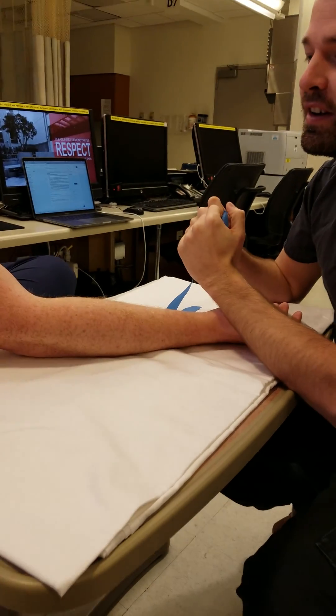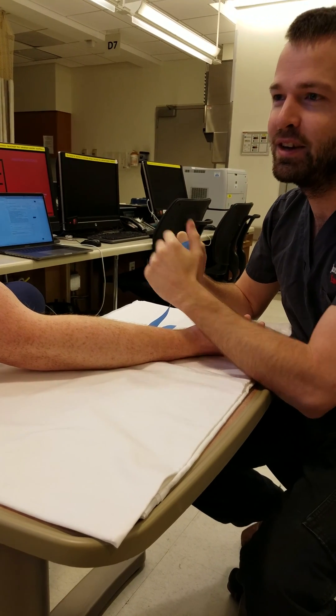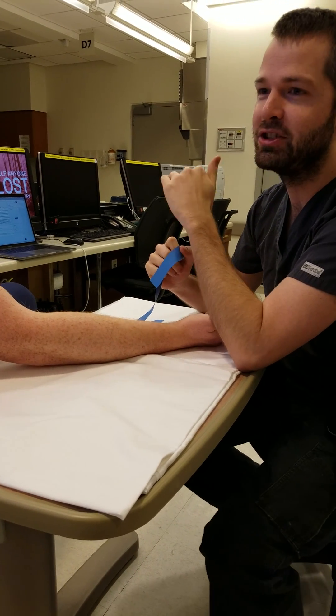Today we're going to teach you how to put on a tourniquet correctly. The correct way to put on a tourniquet means: one, you're compressing the veins, which only takes 10 centimeters of water to do, and two, the patient should be comfortable.